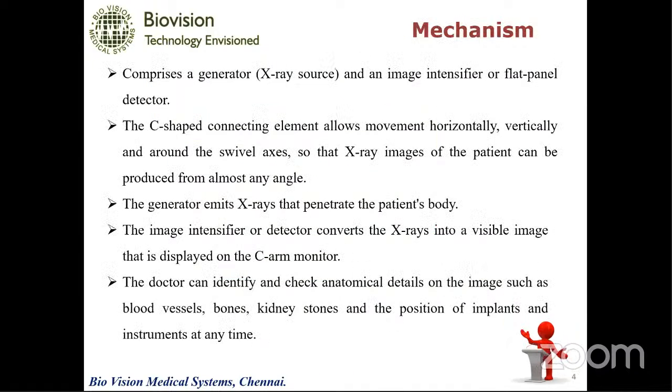So the mechanism here of the working of a C-arm, I'm not going in depth with the instrumentation, because most of us will know when we talk about imaging that X-ray is a very important modality of imaging, and most of us here would know how X-ray imaging works, how a normal X-ray works with soft and hard X-rays, how bones are captured, how a thick tissue is captured. I'm sure you will know that. So having this in mind, I am proceeding further.